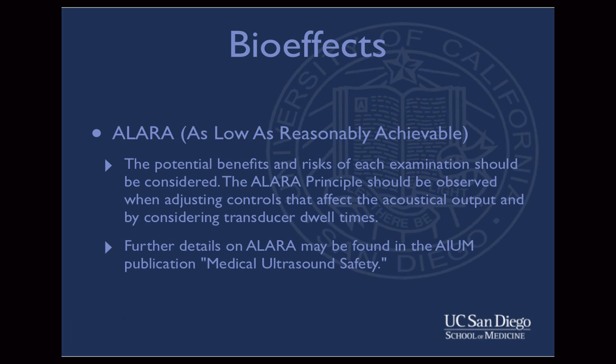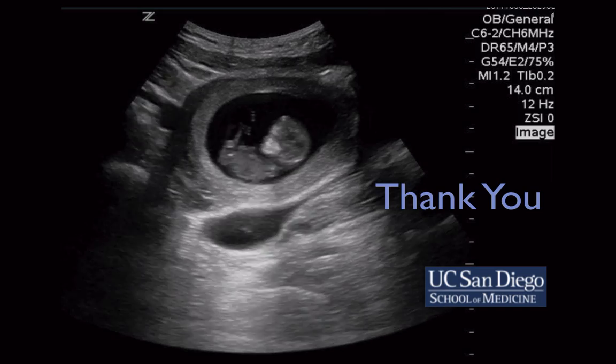The potential benefits and risks of each examination should be considered. The ALARA principle should be observed when adjusting controls that affect the acoustical output and by considering transducer dwell times. This concludes our introduction lecture.